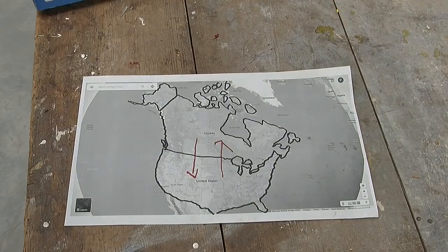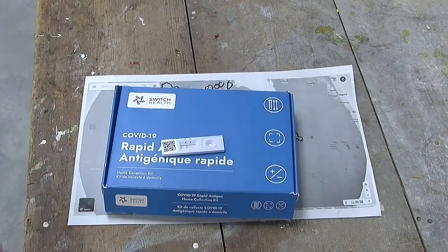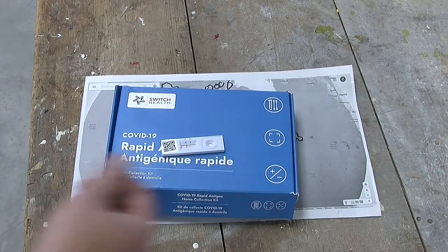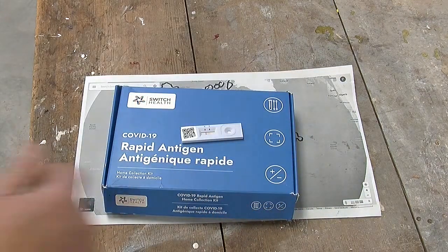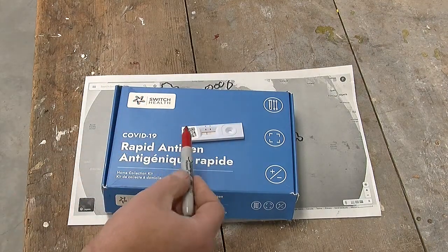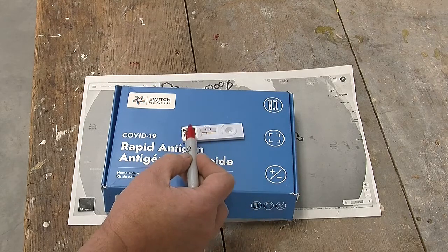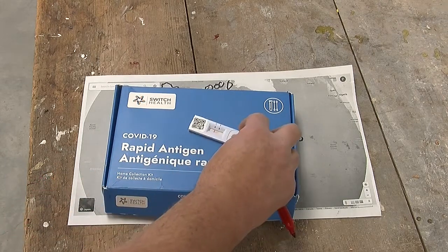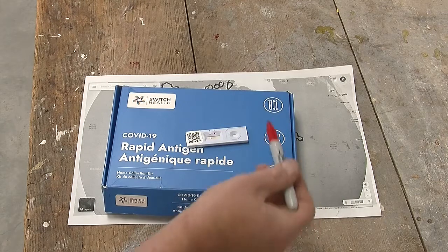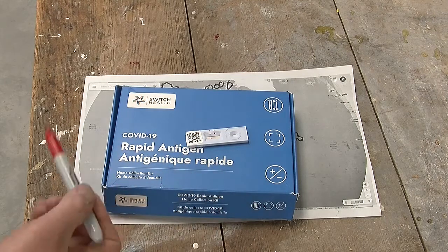Both of these tests were rather interesting because they were do-it-yourself at-home kits, and this company Switch seems to have done a remarkable job at taking standard off-the-shelf kits. This is a rapid antigen one right here, and videoing you performing the test on yourself and using these non-removable serial number stickers to be able to confirm that the test that you dropped your sample on is the test that you later submit a photograph with the results.